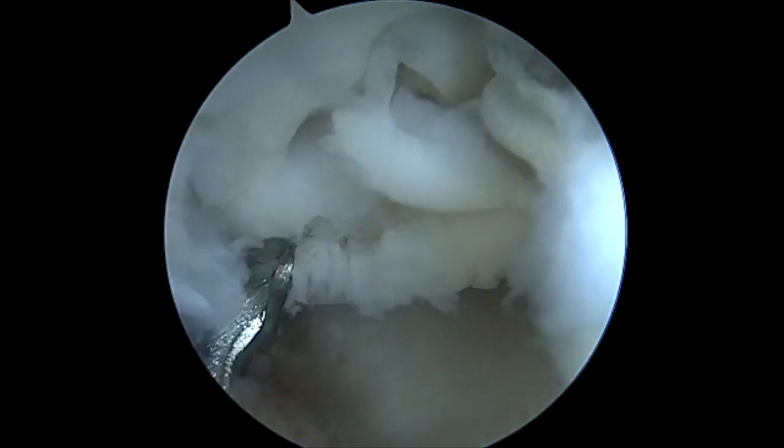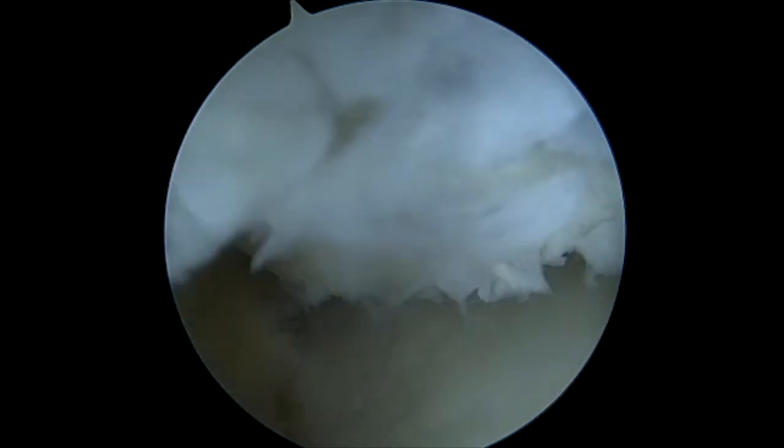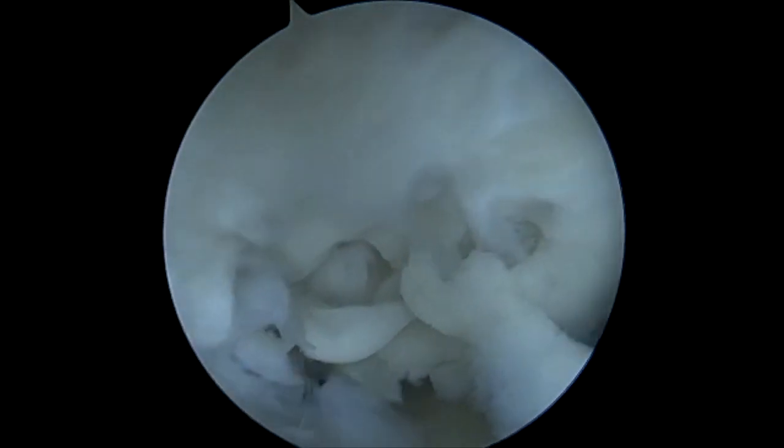We're using a very small curette here to remove the OCD itself from the capitellum of the elbow. This is slightly tedious but an important aspect — to remove the entire base and all of the loose cartilage to avoid any further loose bodies or other issues.